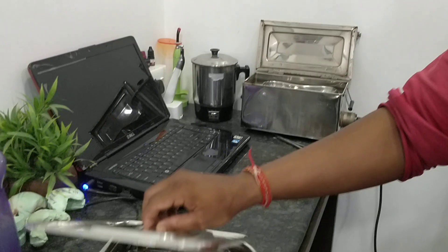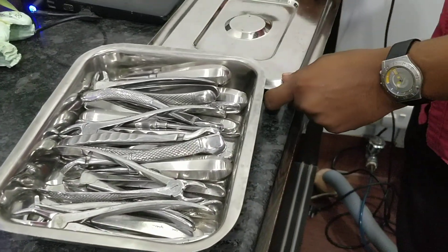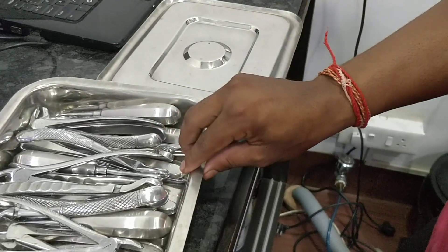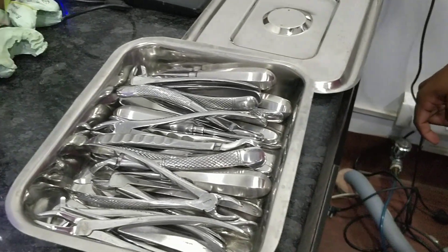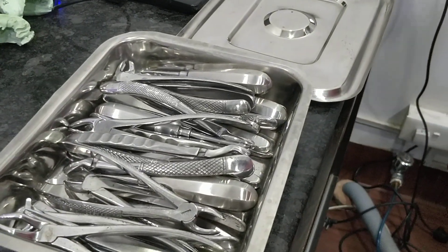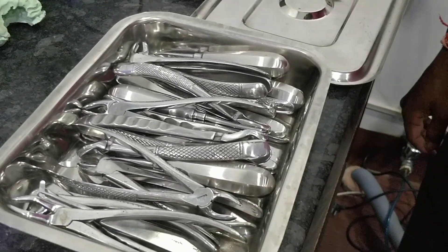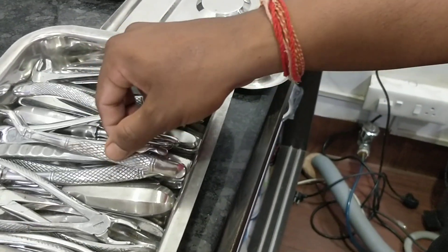First I am going to show you the basic instruments. This is the extraction instrument. This is a steel box and all the extraction instruments are present. You should keep it separately — see how nice and clean it has been kept. You have to train your attender to do like this. This is a Visa company set — Visa extraction forceps — and all the forceps are there.